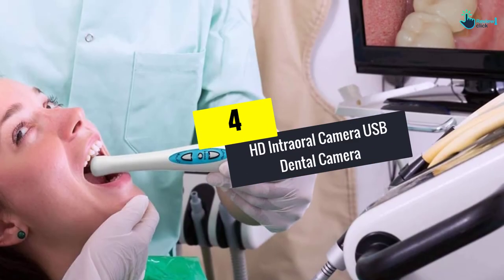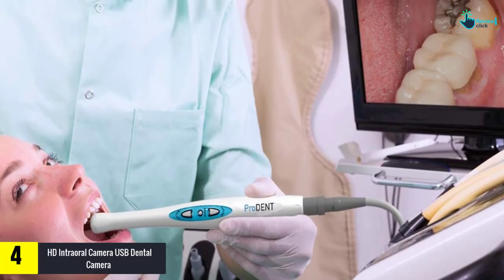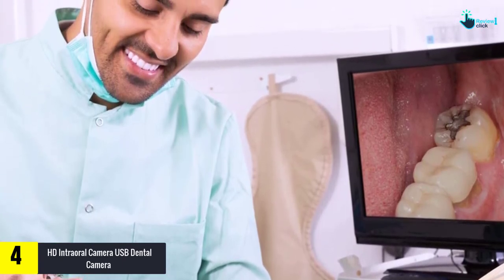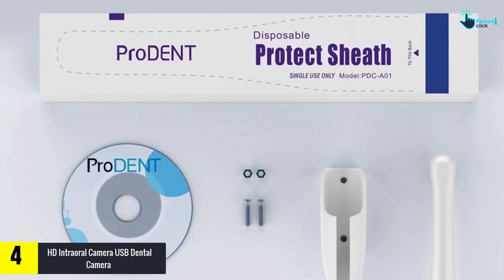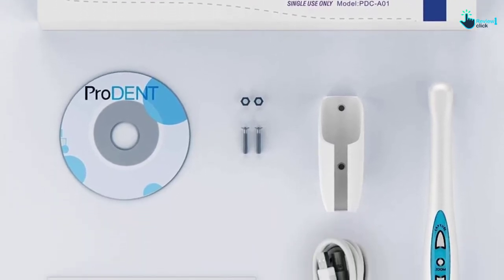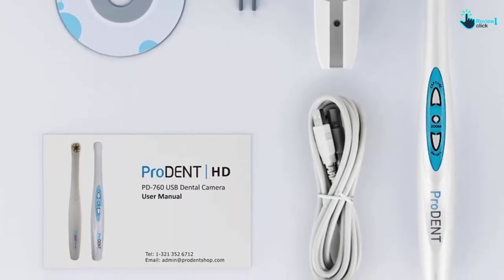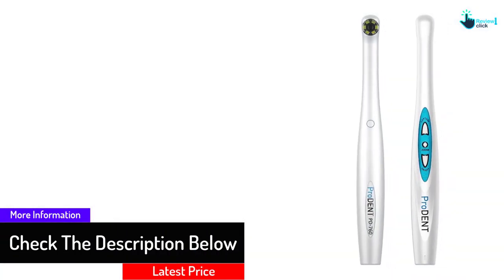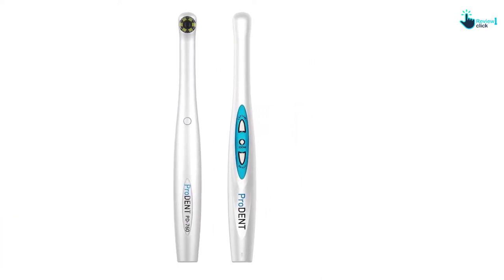Moving on to number 4, we have the HD Intraoral Camera USB Dental Camera. With this camera you can capture high quality images of 720p. It comes with multiple software features and does not require any driver installation, offering plug and play connectivity. You can easily use it on different Windows systems including Windows 7, 8, and 10. It has a plastic surface and is very durable.